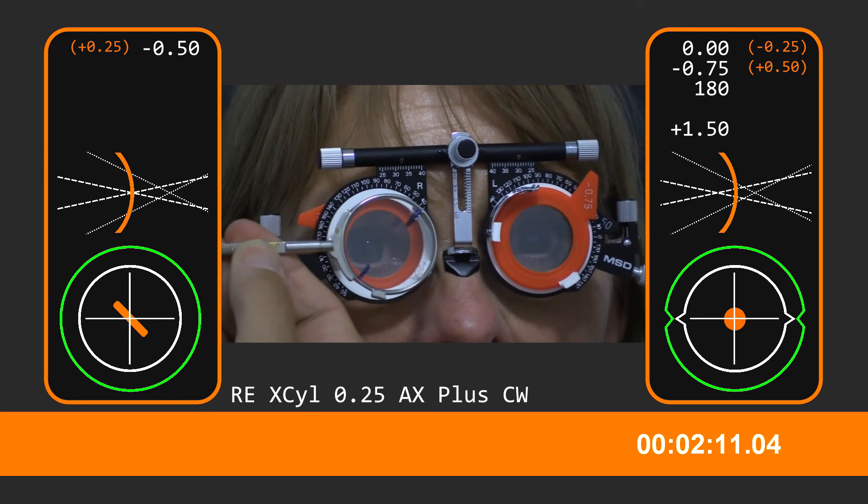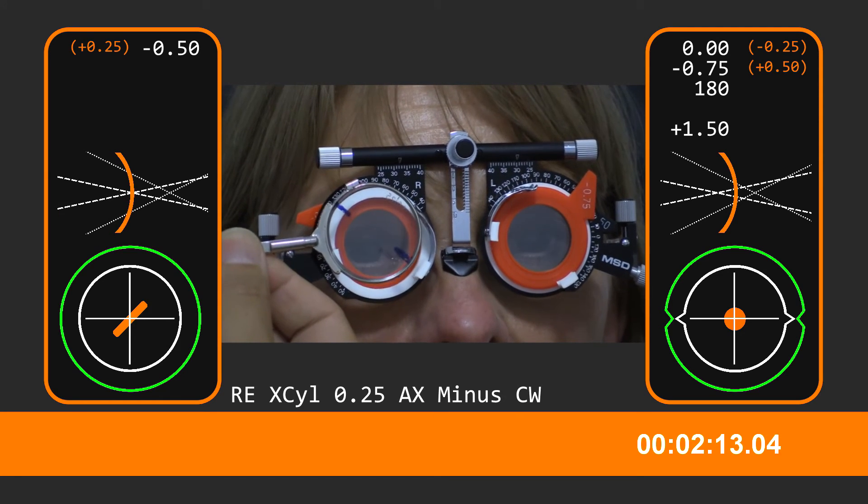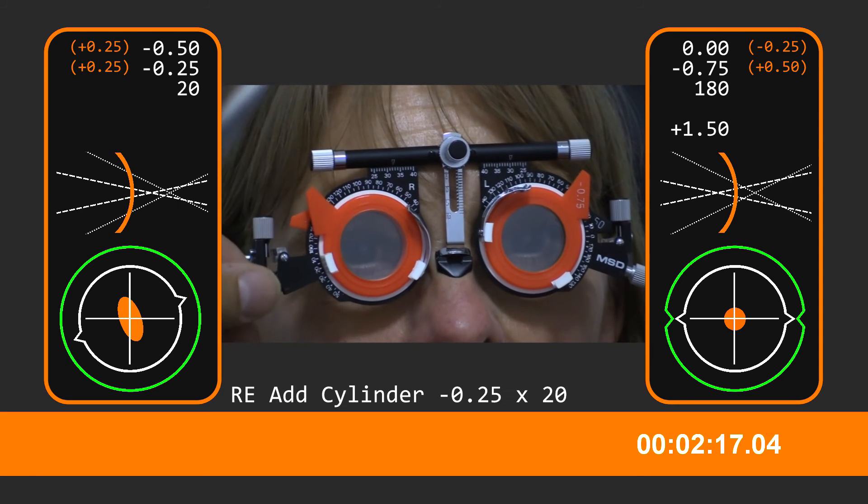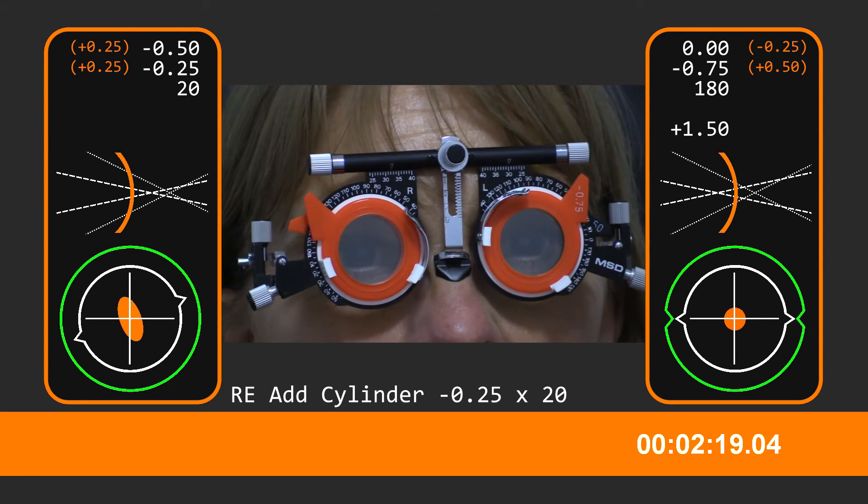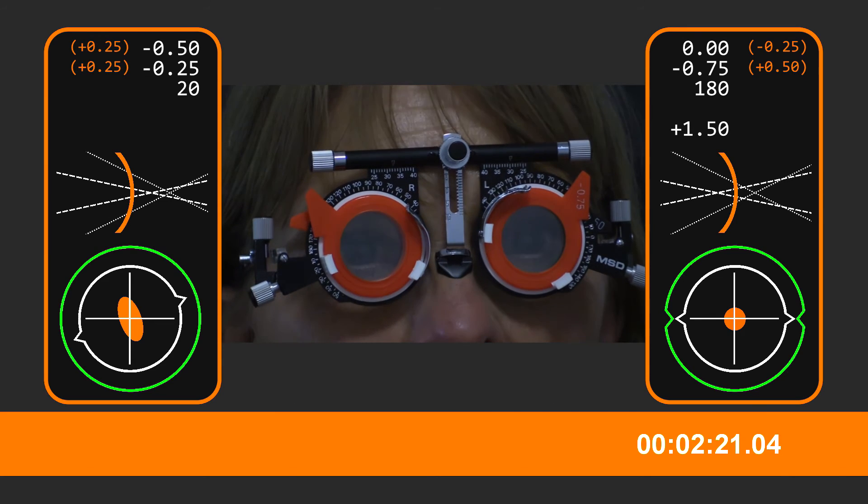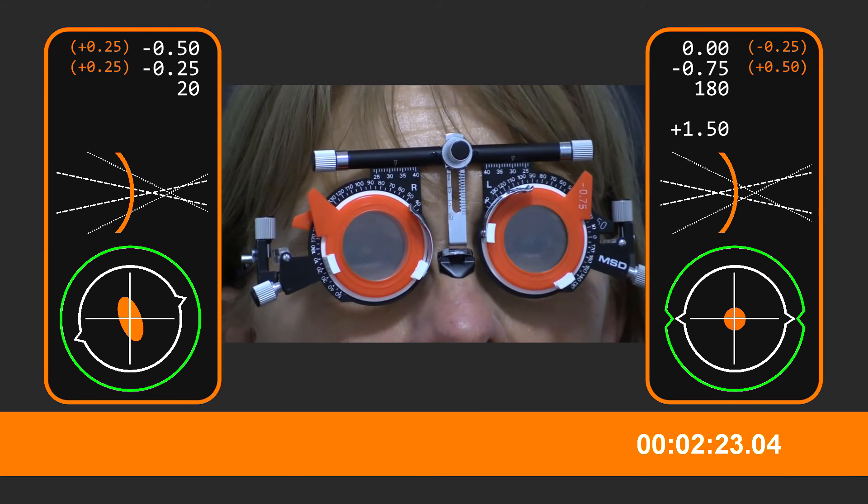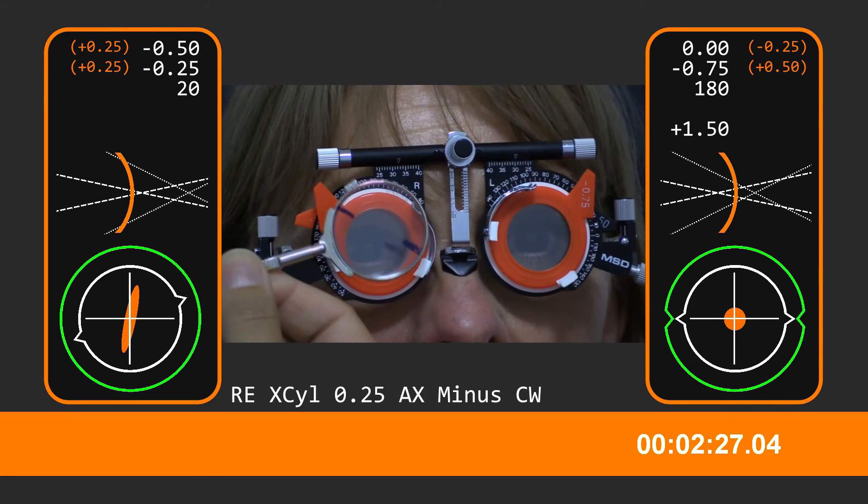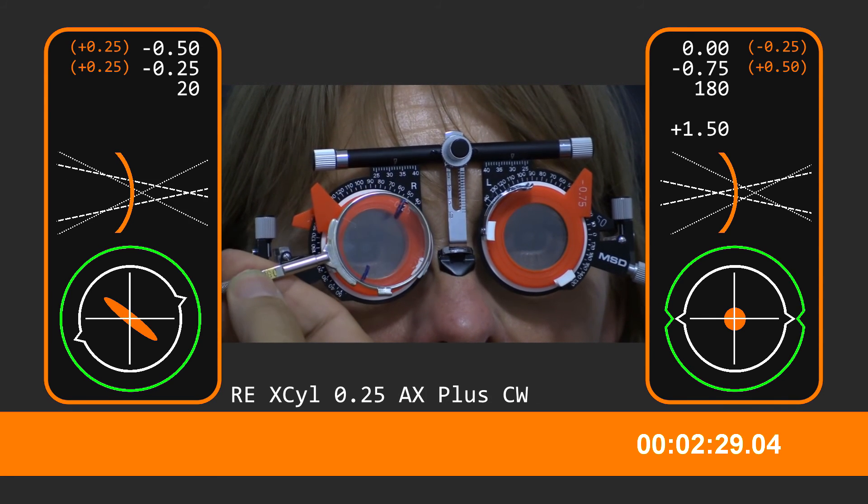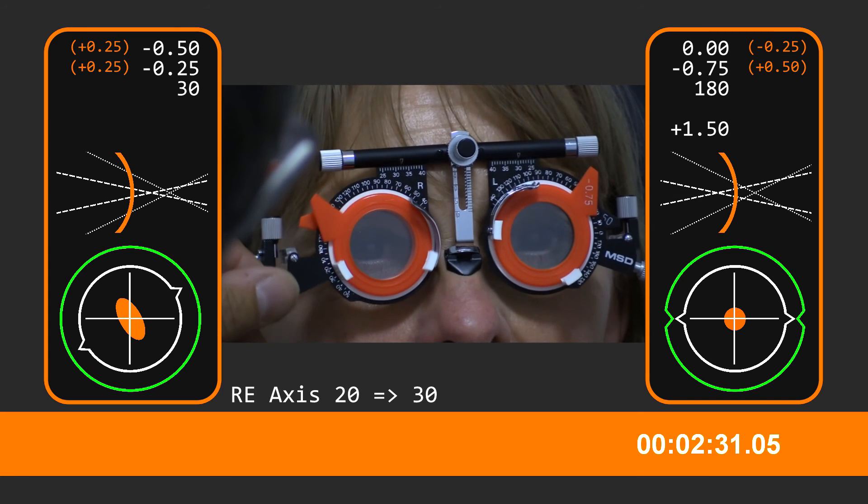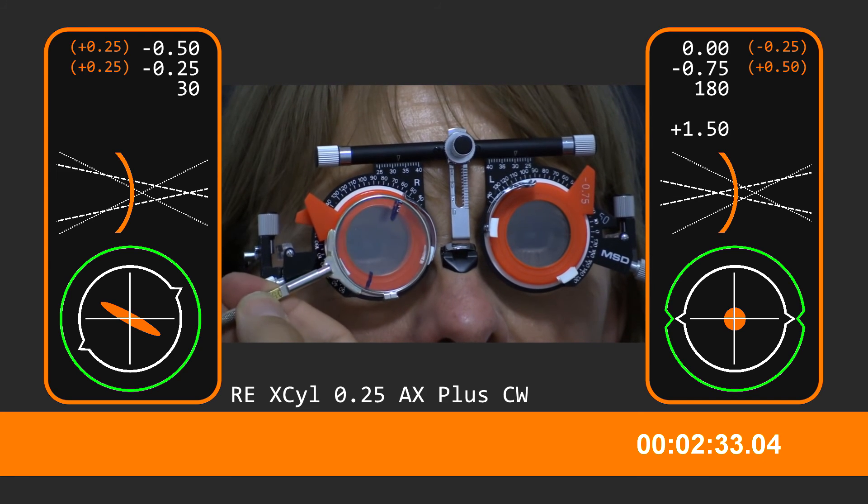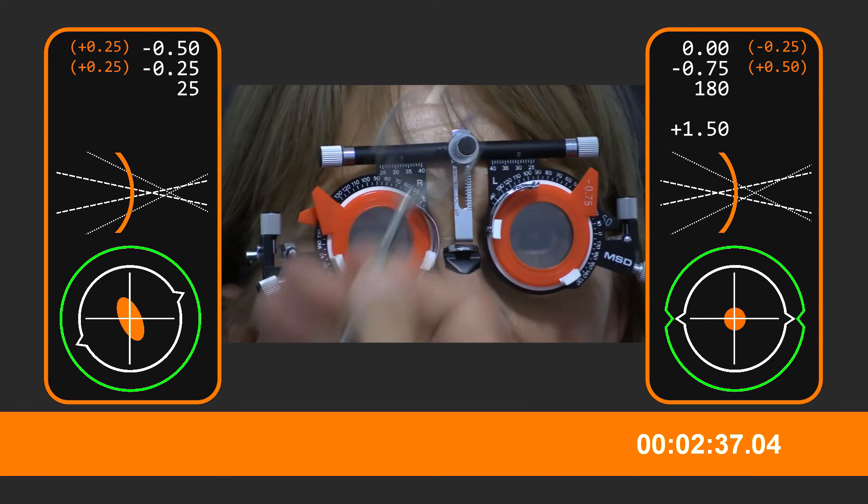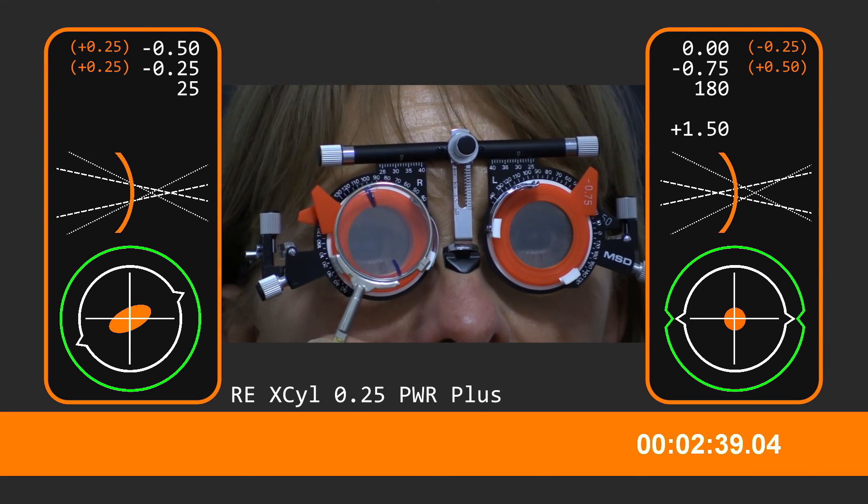And again, first one or second side? And what about these two? The first one or second one? First. And these two. First one. Second. Second one. And these two. First one. Second. Second.